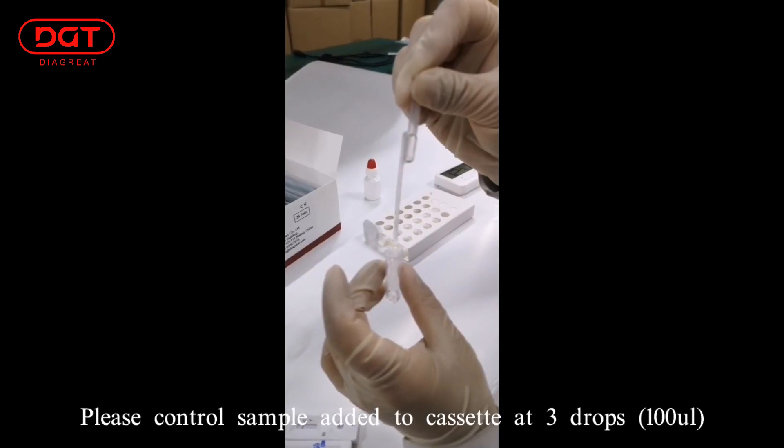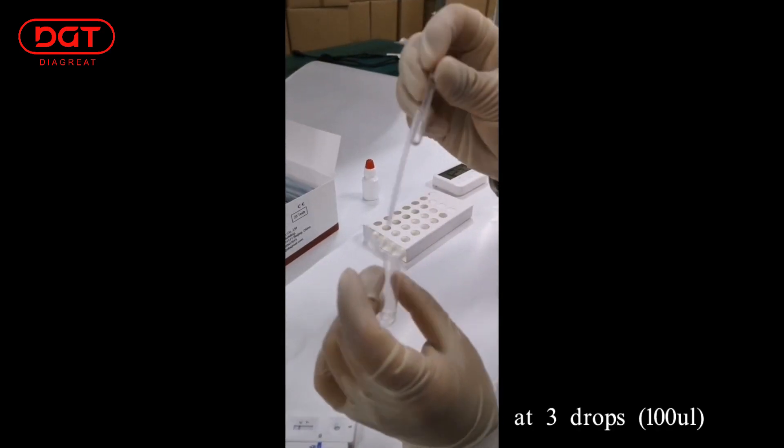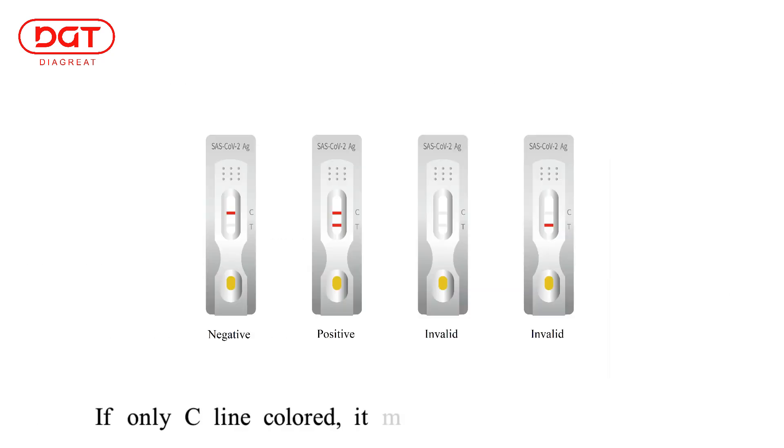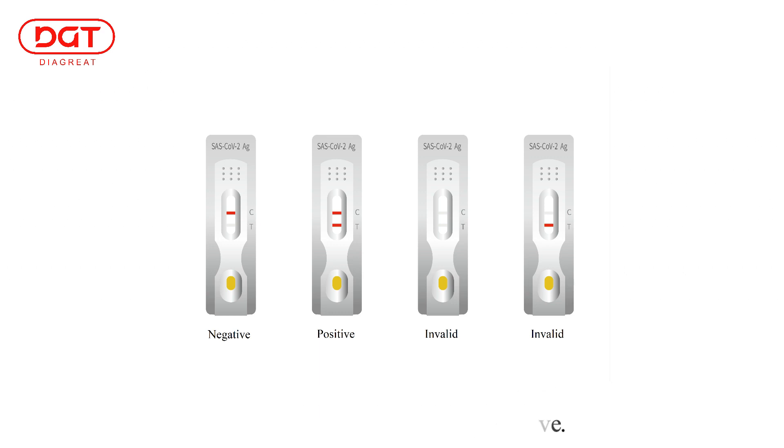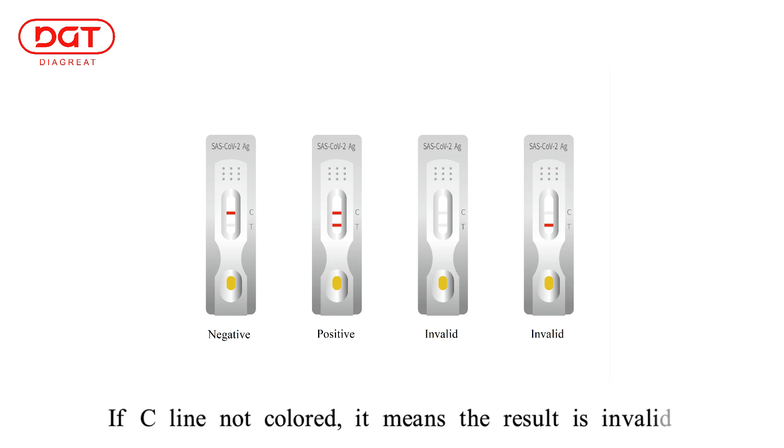Please control the sample added to the cassette at 3 drops. If only the C line is colored, the result is negative. If both C and T lines are colored, the result is positive. If the C line is not colored, the result is not valid.